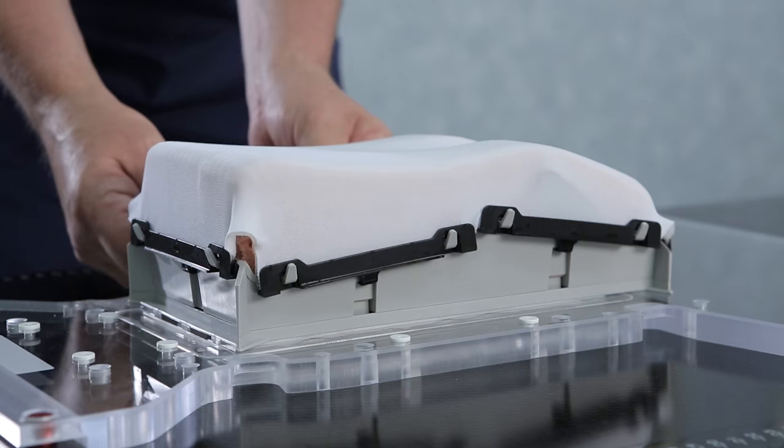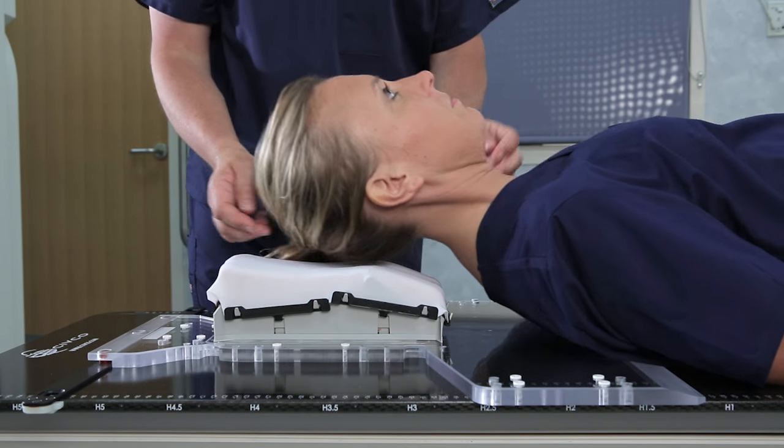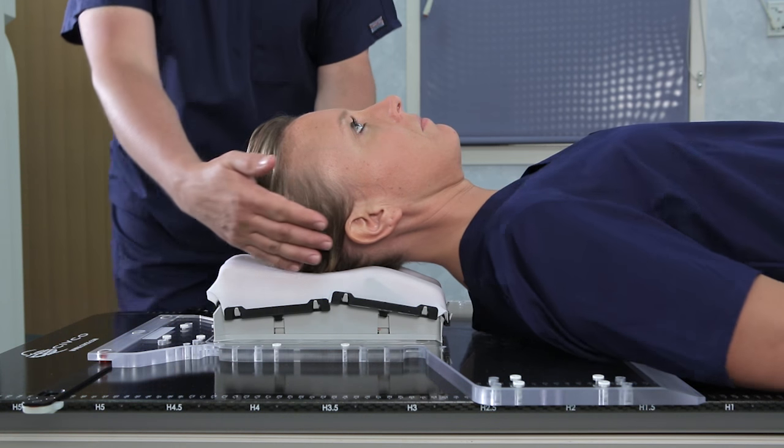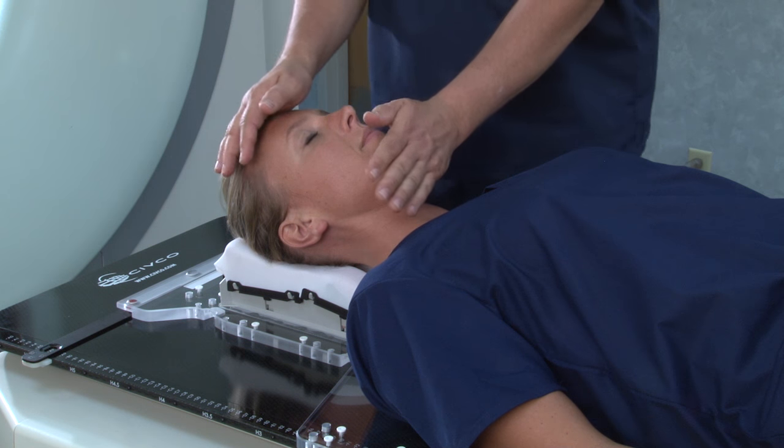Then, have the patient lie down on the headrest, ensuring the patient is superior enough on the headrest to allow clear access to the arch docking points. If the patient is too inferior, the arch will be difficult to attach.